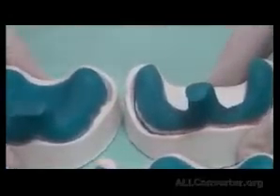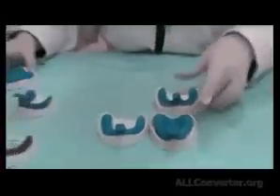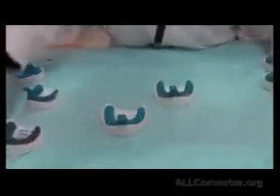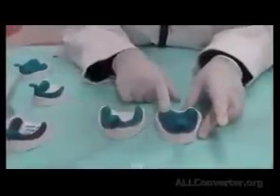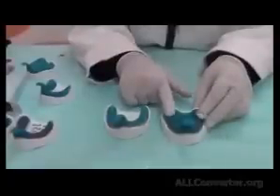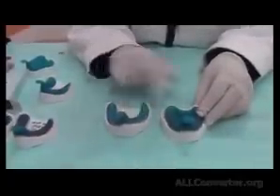For your training purposes, we have asked one of you to do the selective pressure technique with the lower perforated tray, and one student to do the partial relief of the upper. And you will be exposed to both experiences.